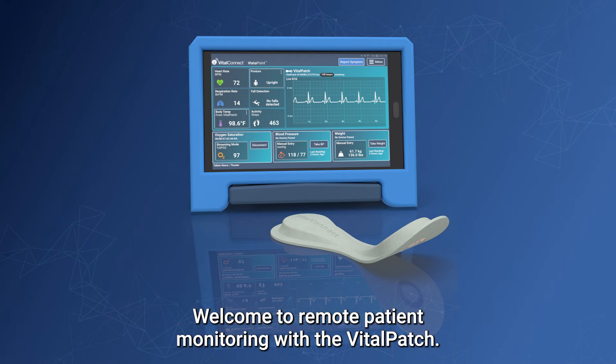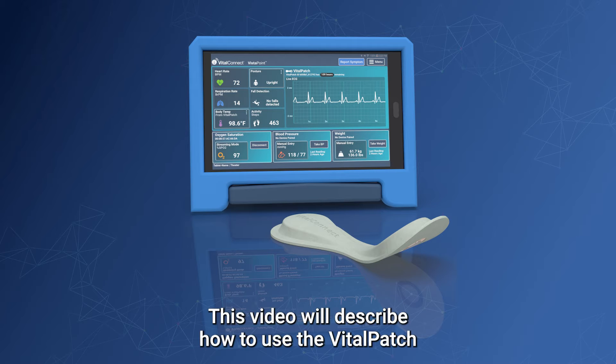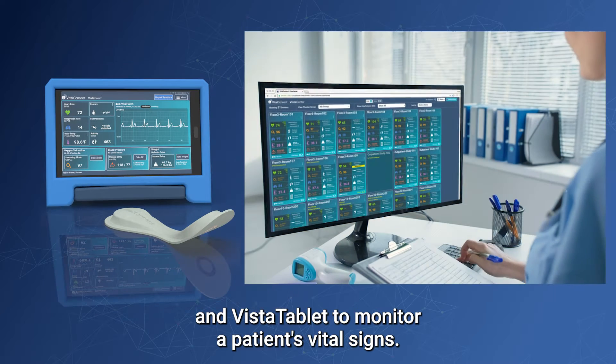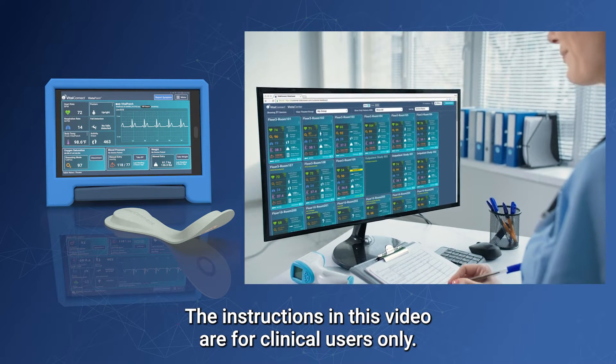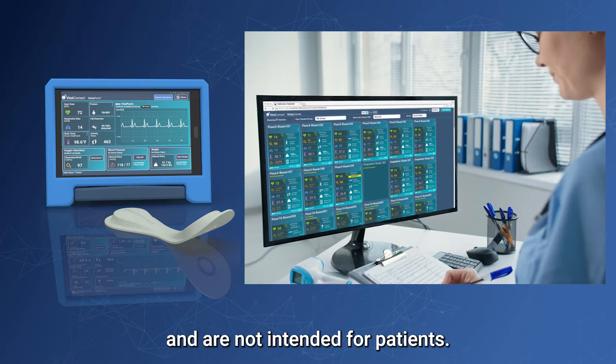Welcome to remote patient monitoring with the Vitalpatch. This video will describe how to use the Vitalpatch and Vista tablet to monitor a patient's vital signs. The instructions in this video are for clinical users only and are not intended for patients.